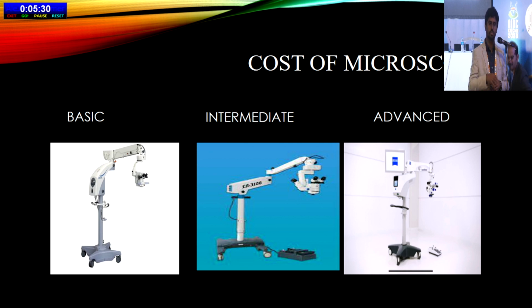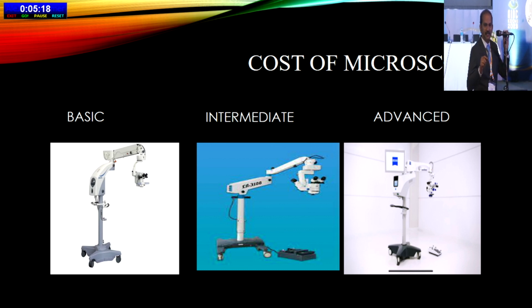No. You tell them to put it in your theater. You do 3 to 5 cases. Exactly, that's what I also wanted to stress on. You need to have hands-on experience in your own OT, in your own surgical chair with your patients.